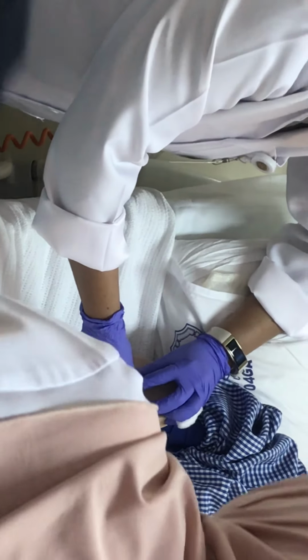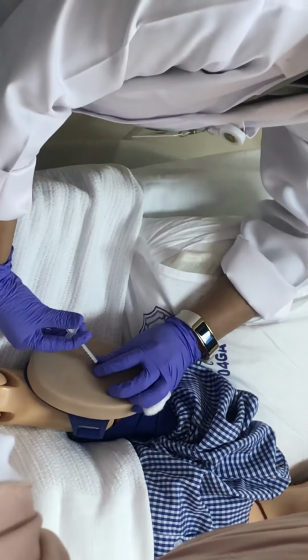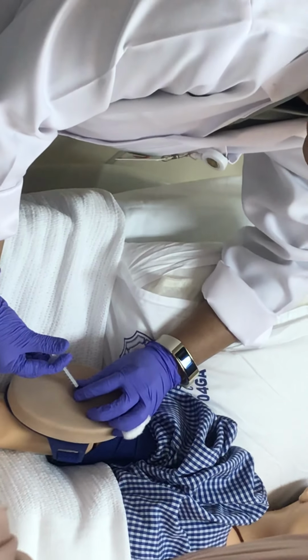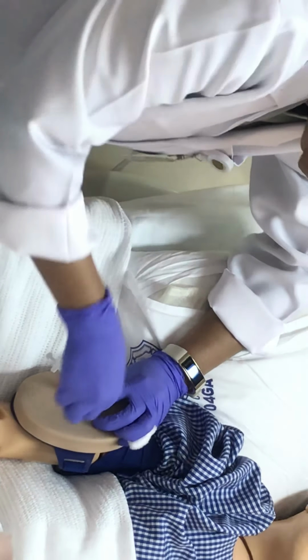Leave this hand as support. The thumb will hold this syringe. Then push the medicine. Okay, teach them this technique. 1, 2, 3, okay, 4. All these are very hard. The medicine is not going inside.